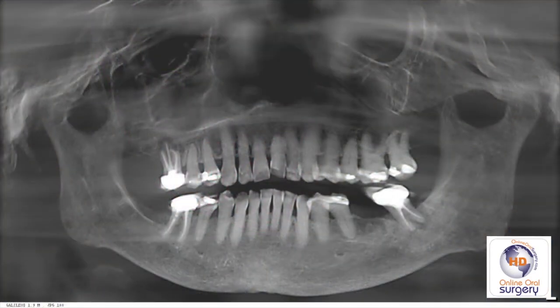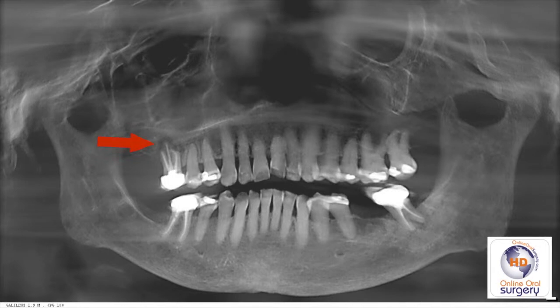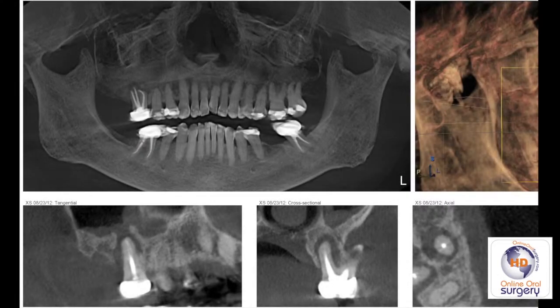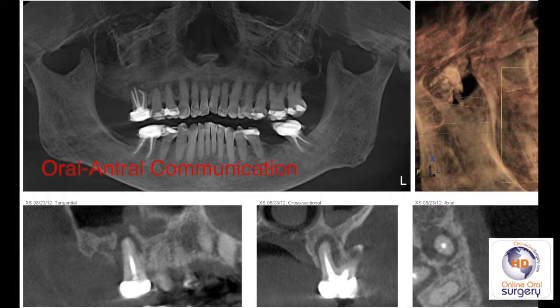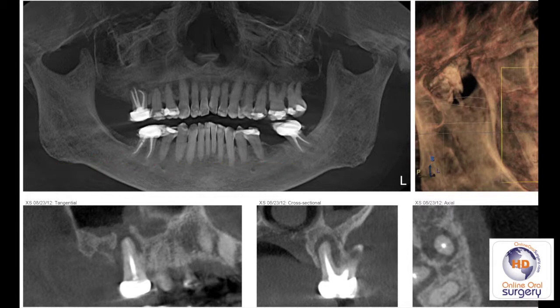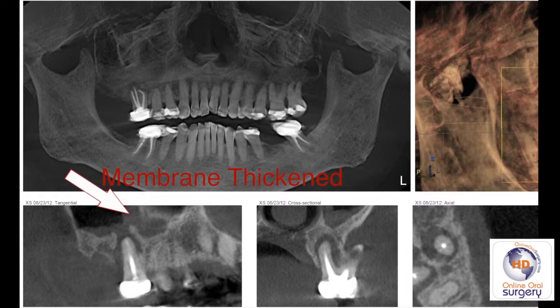Our radiograph of choice in this case is a cone beam CT. On the Galileo panoramic projection you'll notice right away there's a radiolucent lesion at the apex of tooth number three. Looking at other slices, there is a rather large area of radiolucency at the apex of the palatal root of tooth number three, and this radiolucent area actually perforates into the maxillary sinus. It's a fairly extensive lesion — it not only perforates into the sinus but there is also reactive thickening of the sinus membrane and fluid in the sinus adjacent to it.